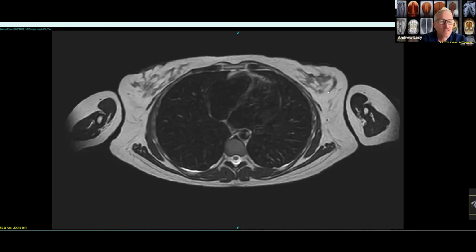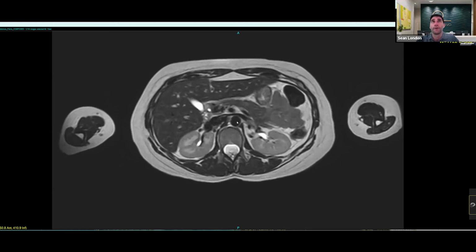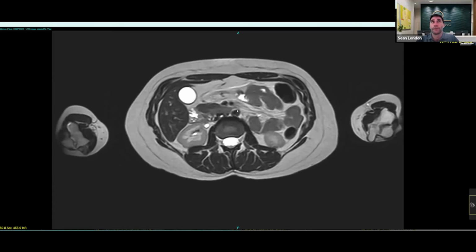There are a few lightning round questions I think are pretty easy to answer. Do we cover abdominal aneurysms? We covered the aorta in the sense that we're looking at its size. I kind of emphasized the one in the chest, but here I can also see it in the abdomen all the way down. And so I do look at this as well to make sure it's not abnormally dilated or aneurysmal. And so yes, the answer is yes.